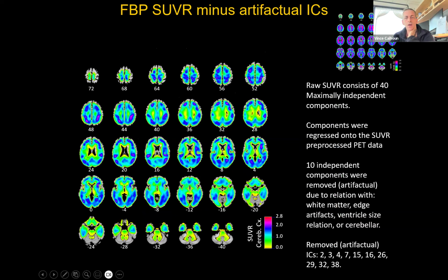So if we start with this data set, we apply ICA, and then we subtract out the white matter and CSF components, and then reconstruct the data set, you get this here, which again, these are controls. So even in the controls, you can start to see the distribution very clearly in the gray matter areas. And then you could take this image and just analyze it in some other approach if you wanted to. So you've kind of denoised, or it's sort of like a partial volume correction, an ICA-based partial volume correction.